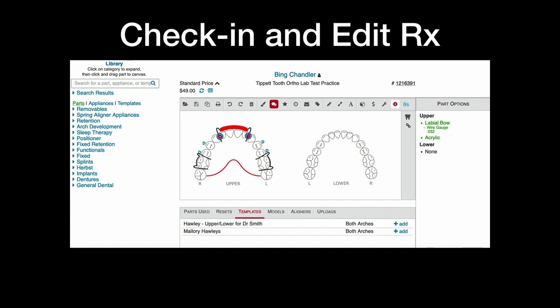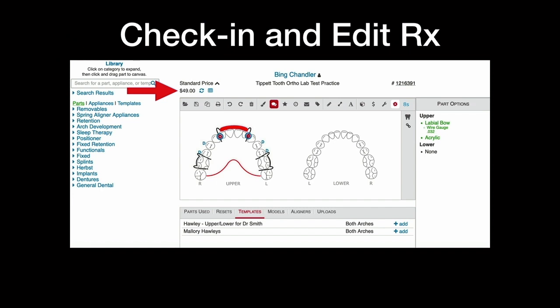So this is the edit screen. This little circle right here, you can actually move it and it will stretch out that labial bow over different teeth. You can move the Adam's clasp up and down. If it's a C clasp, you can move it up and down and around. So you have the name up here, and you can actually click on the name and see all the scripts associated. So if it's a patient, it keeps coming back and coming back and coming back, you can see how many scripts you've made for them and what you made. What was the last color you made it, what was the shade of the Pontic you made last time? You can pull up all that info right there. And then you can actually see this in labs. But as you build this thing, as you add an Adam's clasp, it puts that on the invoice. And then as you drag over the acrylic, it puts it on the invoice. So you see a parts list, labial bow, you can choose wire gauge.